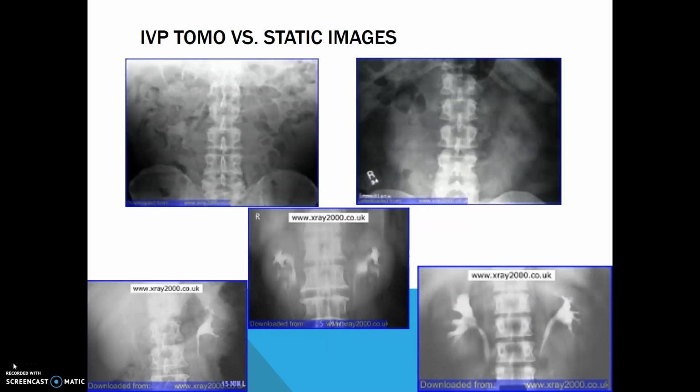This shows an example of the difference between IVP tomography image and static images.